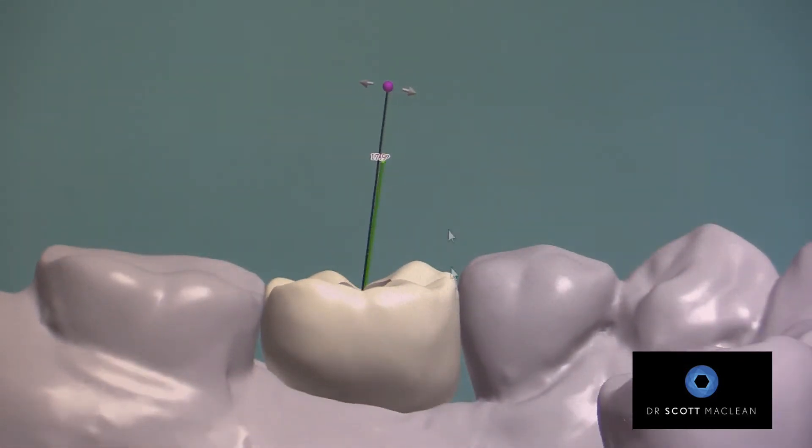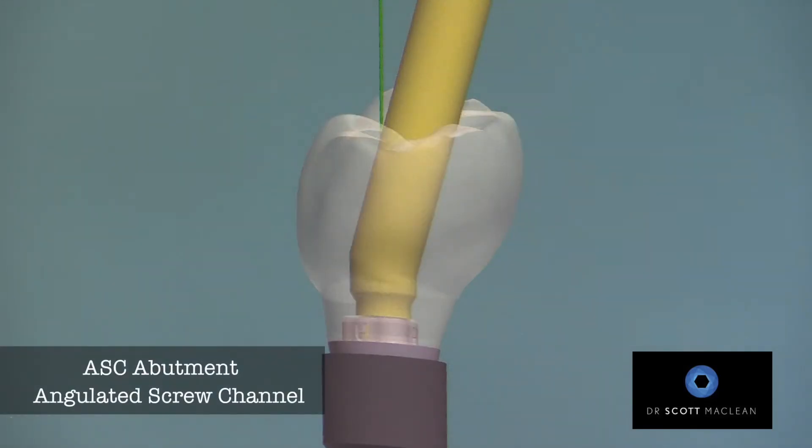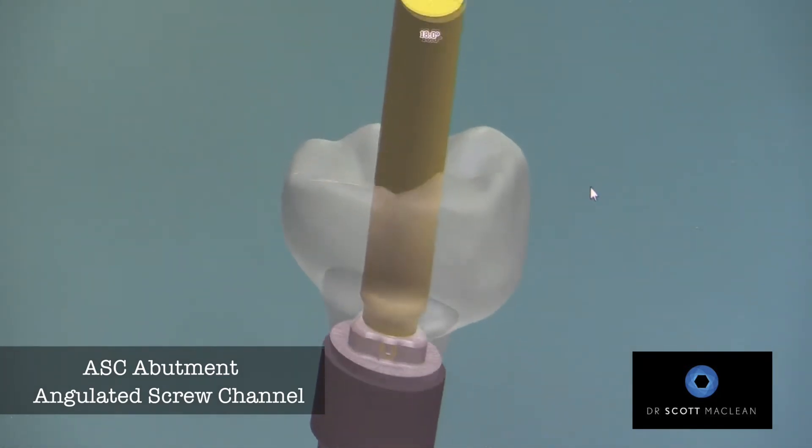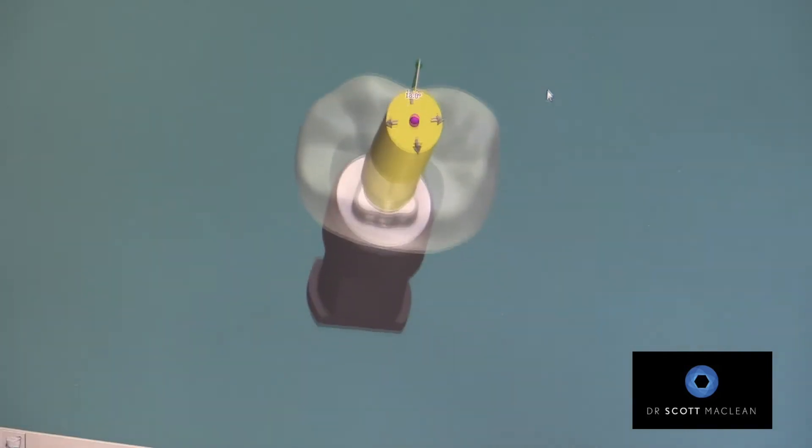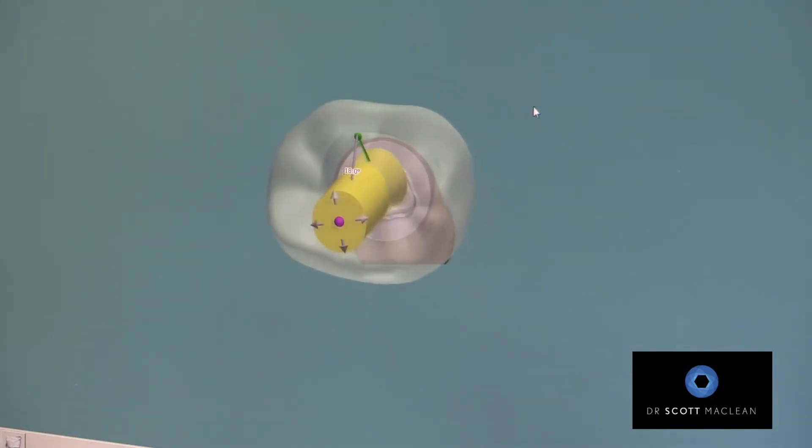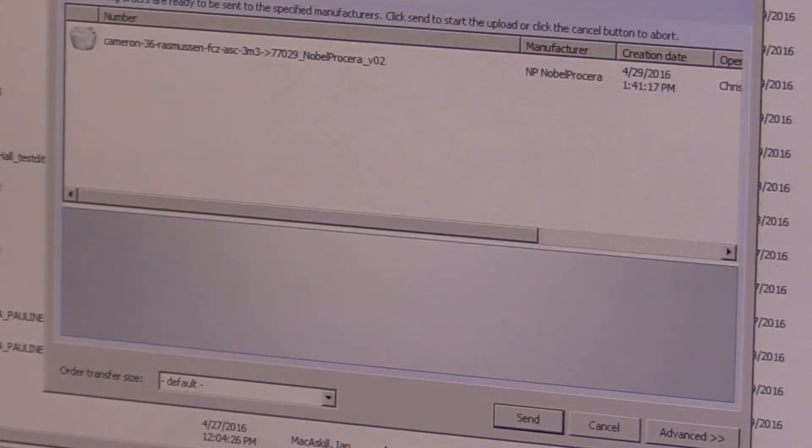And then we can use the OmniGrip screw, so you'll notice that the screw is going to be going down through this channel. And we can get to the screw with this special screwdriver called the OmniGrip screwdriver. So we're able to make everything better by tipping the channel.